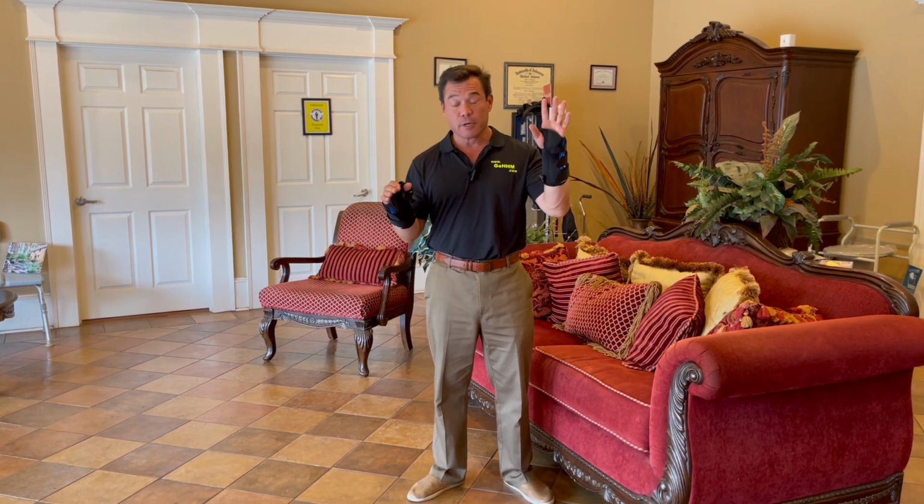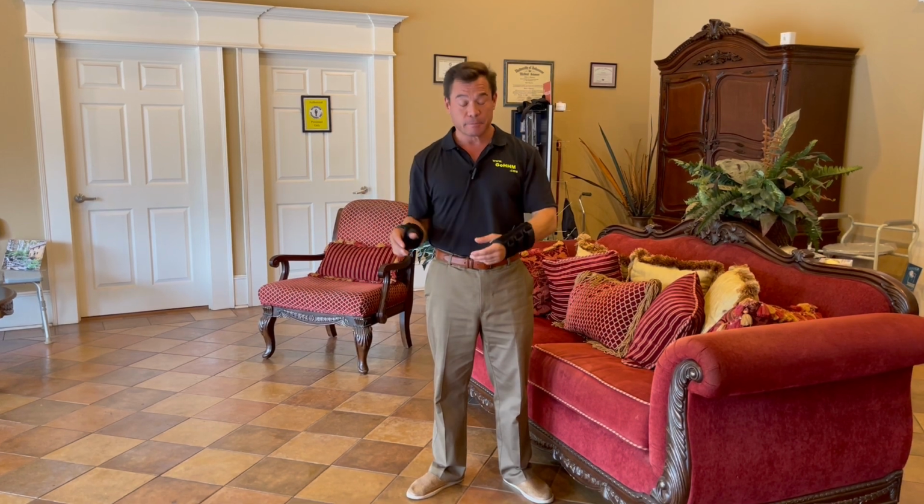And yes, it might look today like I had a really rough 4th of July, but today we're going to talk about wrist braces. The regular wrist brace and the wrist brace with spica.